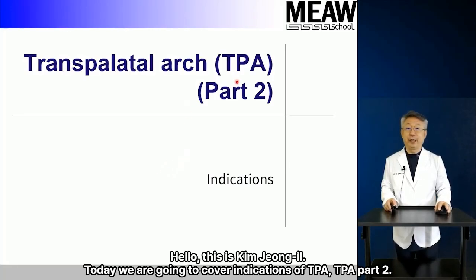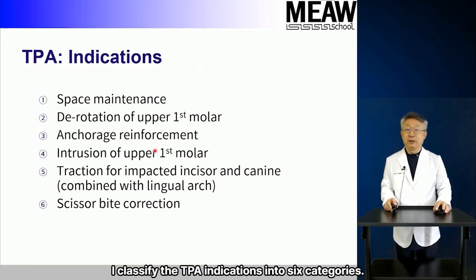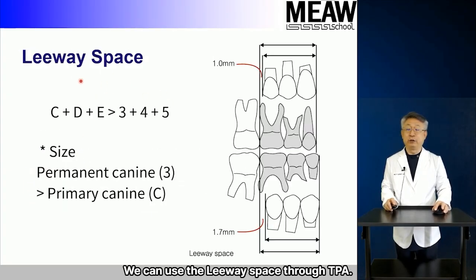Today we are going to cover indications of TPA Part 2. I classify the TPA indications into 6 categories. We can use the leeway space through TPA.